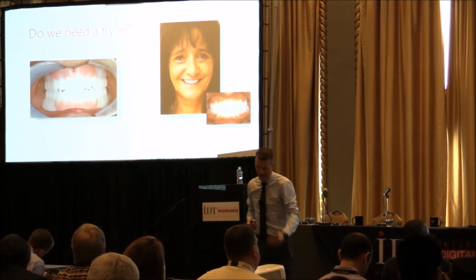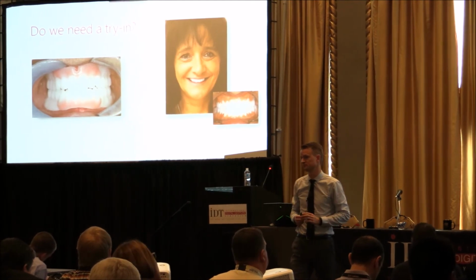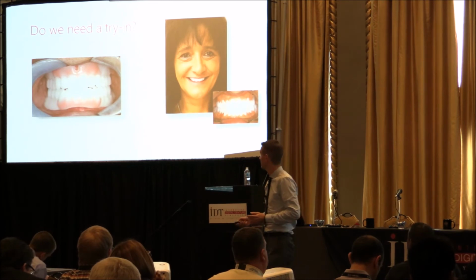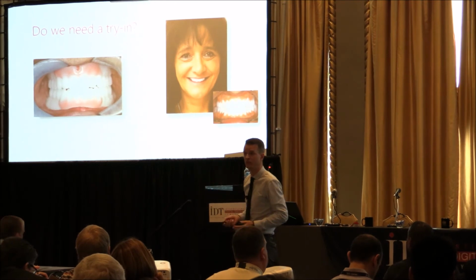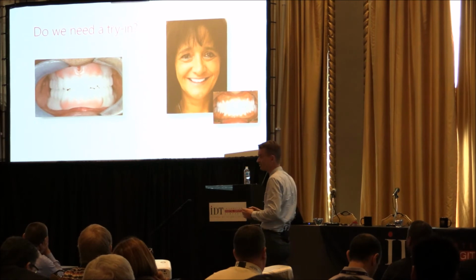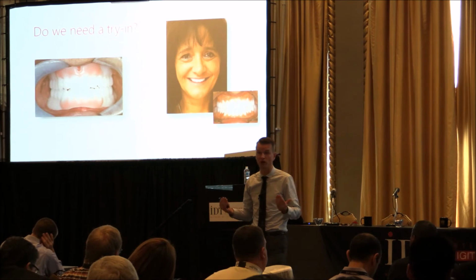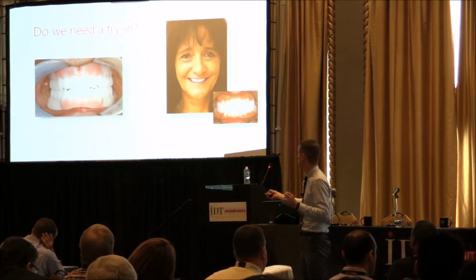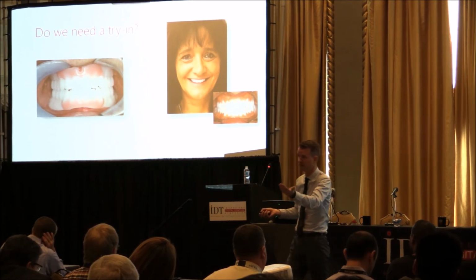All right, so do we need a try-in? Do we generally need a try-in? I think this is an essential question. I still think that the try-in gives comfort, but one thing that is cool is that you don't have to make a traditional wax try-in. There's very common agreement that you can print a monoblock. Some people then like to put a little bit of teeth on so you can move it. But what I hear from most people I talk to is a monoblock is good enough. People sometimes draw on it or do minor adjustments. A monoblock means it's one piece printed or milled at very low cost.